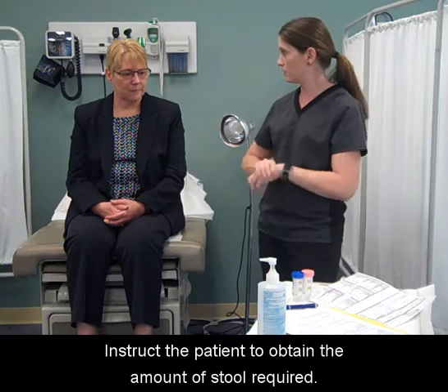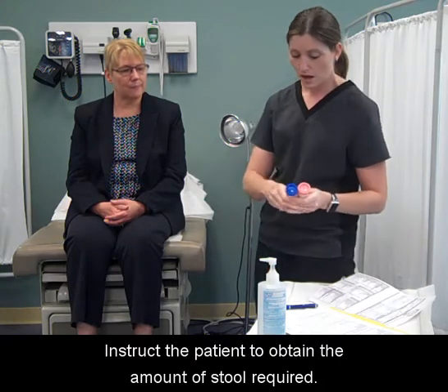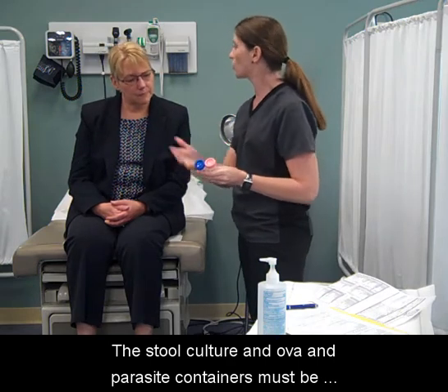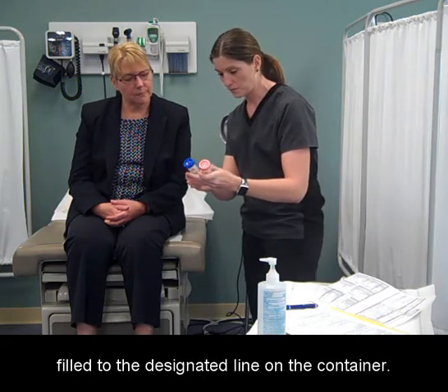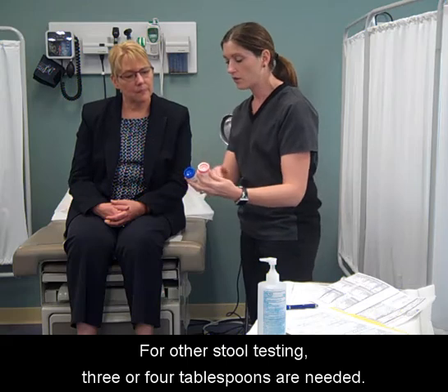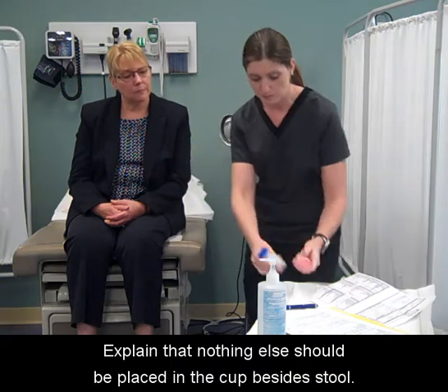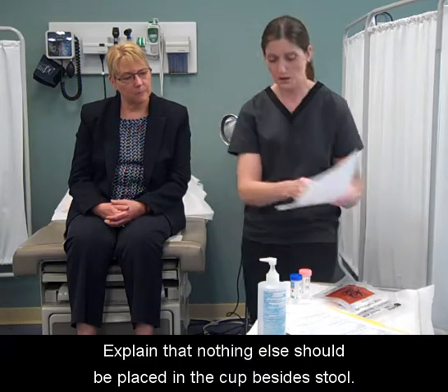Instruct the patient to obtain the amount of stool required. The stool culture and ova and parasite containers must be filled to the designated line on the container. For other stool testing, three or four tablespoons are needed. Explain that nothing else should be placed in the cup besides stool.